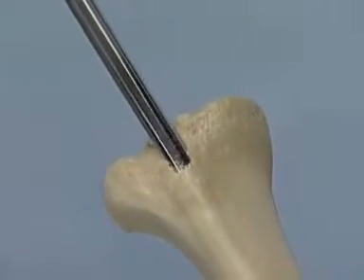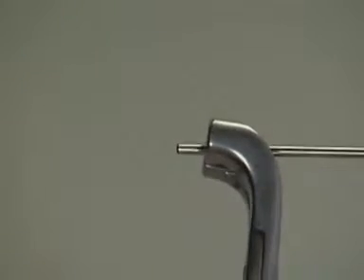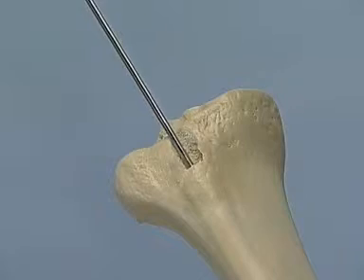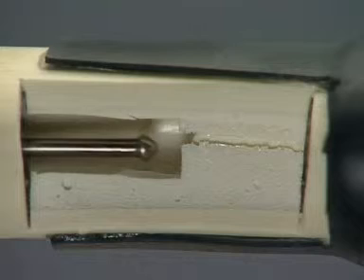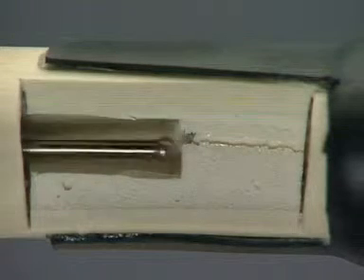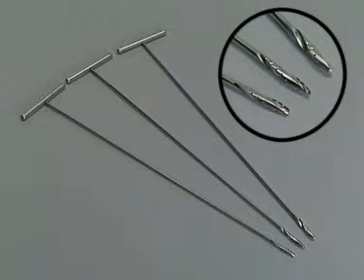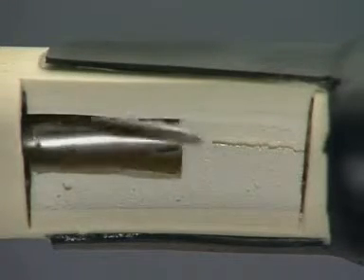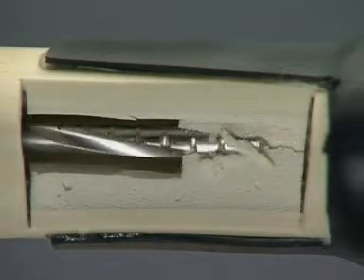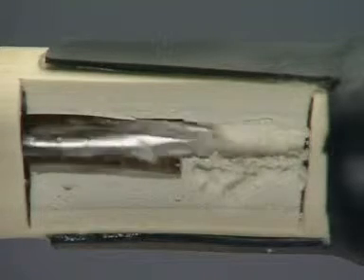After removing the cannulated cutter and the centering pin, the 2.5mm SynReam reaming rod, which has an olive at one end, is inserted. The reaming rod is carefully pushed into the medullary canal with the holding forceps or the T-handle. As is often the case with a hypertrophic pseudarthrosis in practice, the fracture zone cannot be penetrated because of the sclerosed medullary canal, so the reaming rod is removed. The sclerosed medullary canal must first be opened with the hand reamers, with diameters of 6 to 8mm available. After the medullary canal has been opened, the reaming rod is again pushed into the canal.